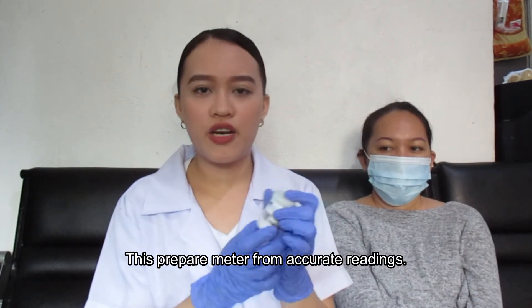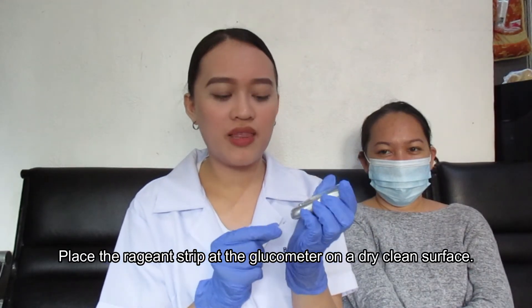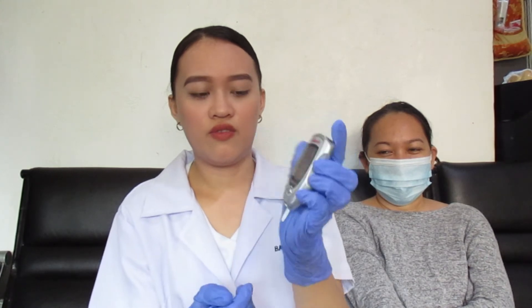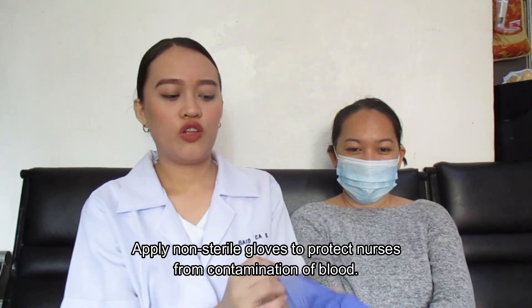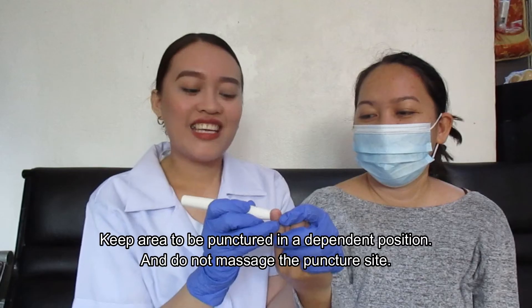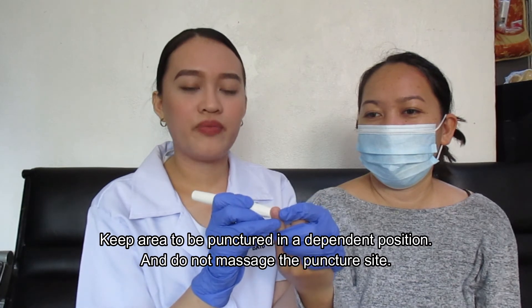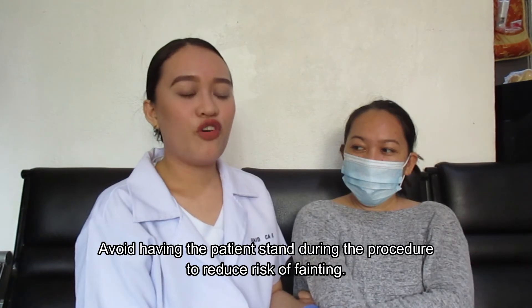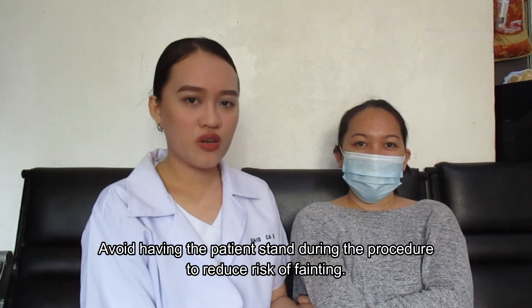Follow the manufacturer's instructions to prepare the meter for measurement and ensure accurate readings. Place the reagent strip and glucometer on a dry, clean surface. Apply non-sterile gloves to protect the nurse from contamination by blood. Keep the area to be punctured in a dependent position and do not massage the puncture site. Avoid having the patient stand during the procedure to reduce the risk of fainting.